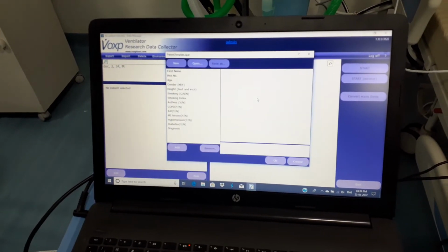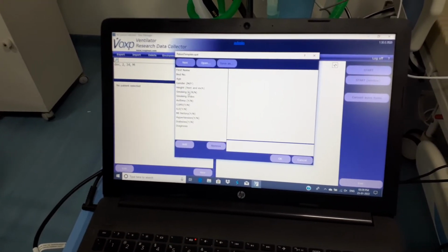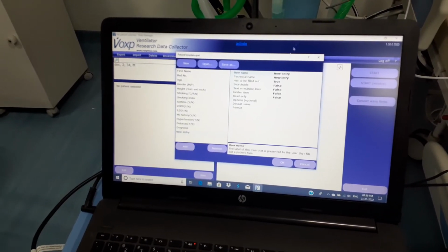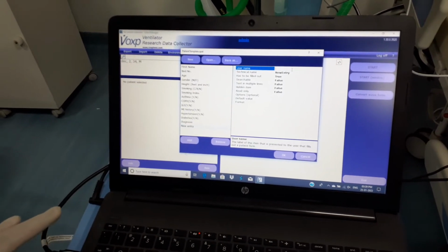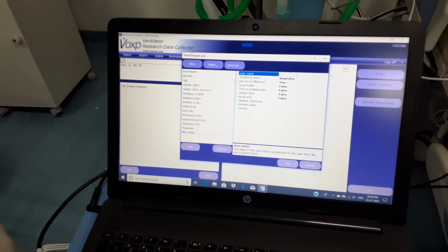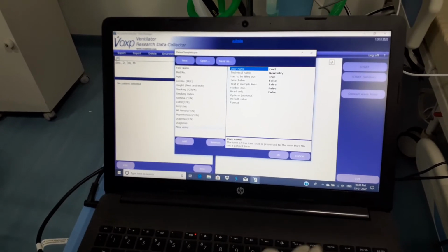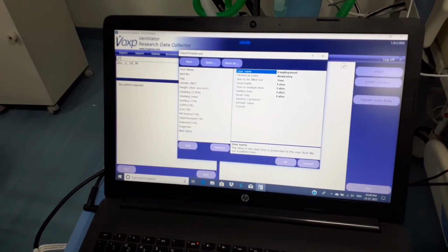customize the template. So these are all the initial parameters that I am noting of the patient, like first name, bed number, age, gender, height, smoking index, asthma patient, these are yes/no, like is he suffering with asthma and all. If we want, we can add new ones also. Let's say a patient family history, or patient employment history, his working environment, it is going to influence his respiratory system. So we can put here employment environment like this.